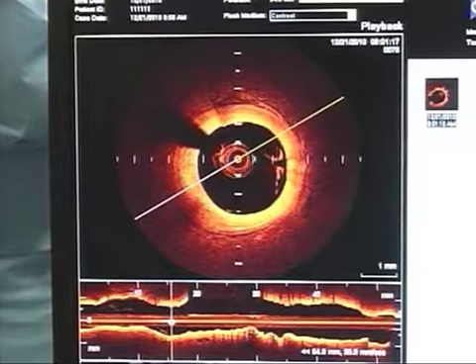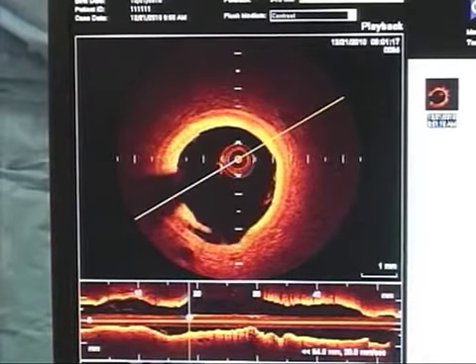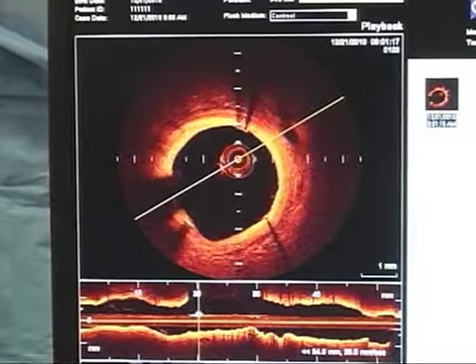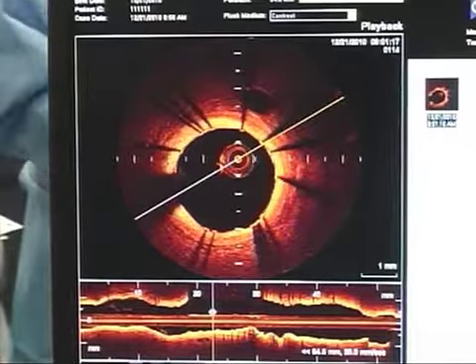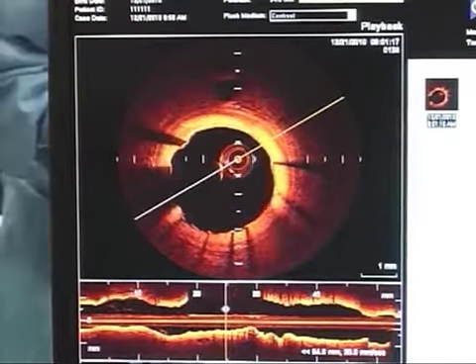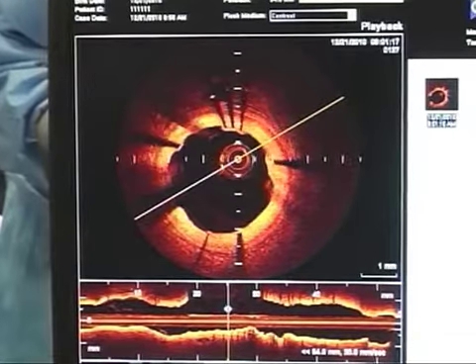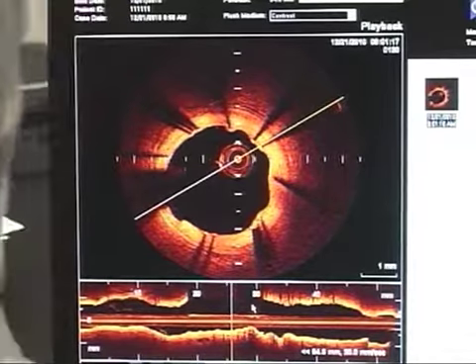In the distal vessel, you see the plaque go in. Now the struts, you see the fingers that are shadows of the struts, and you see very little coverage of the struts. The stent was deployed when? One month ago. Pedro, a very important question: is this stent endothelialized? This patient, not today.